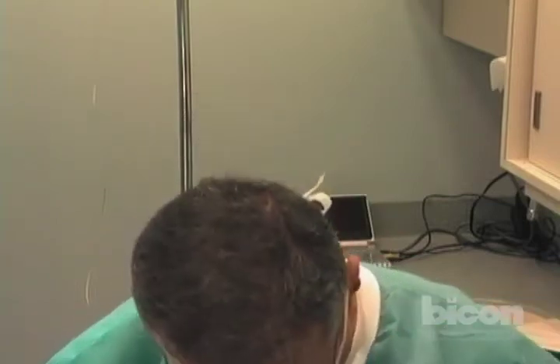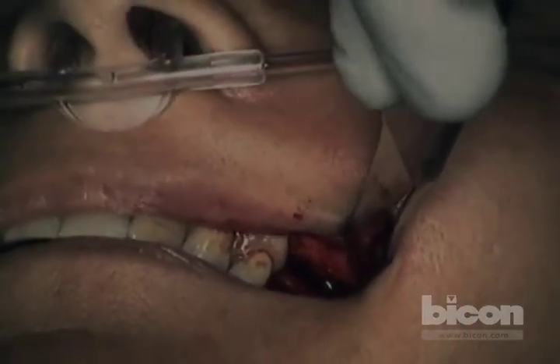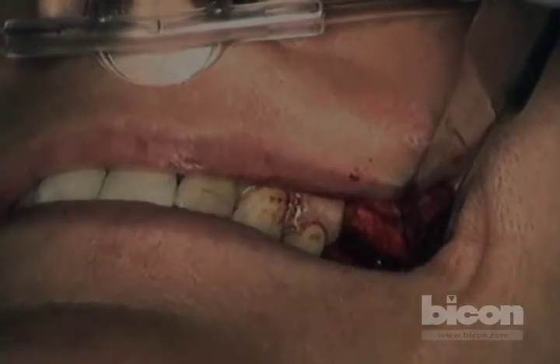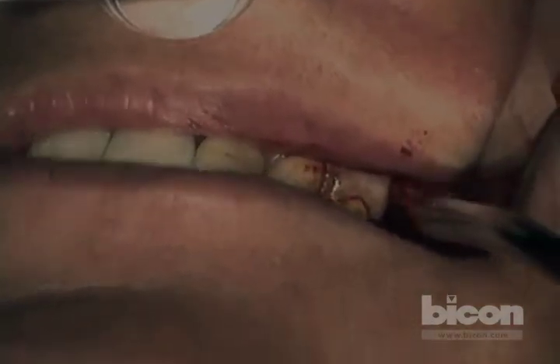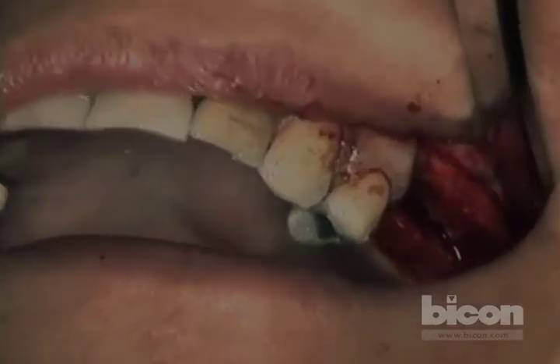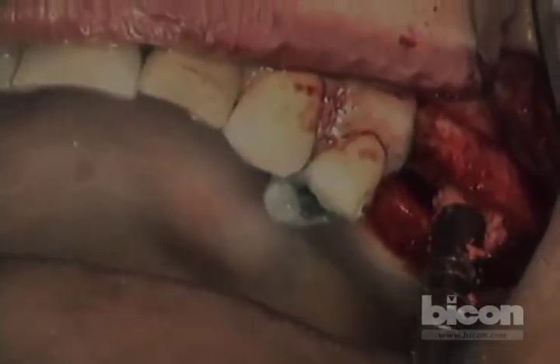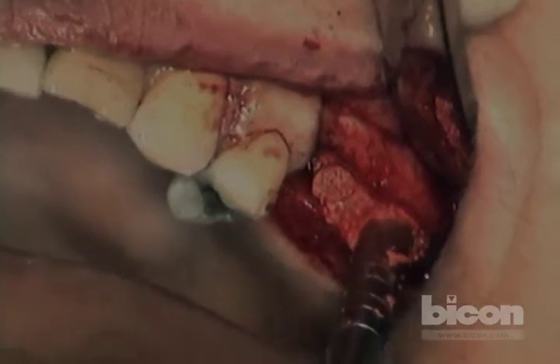Let me place those implants and suture, then we can answer all questions. Much like an internal lift, you will place your bone graft first and use that to mobilize the membrane.